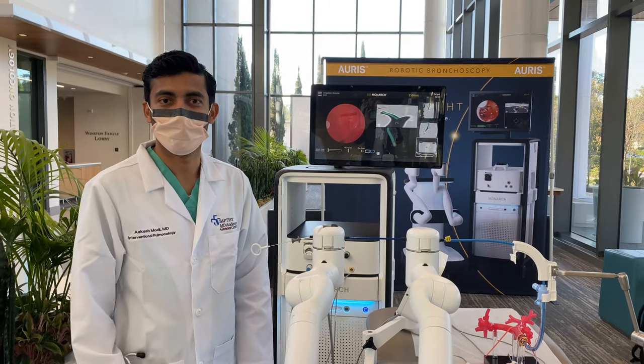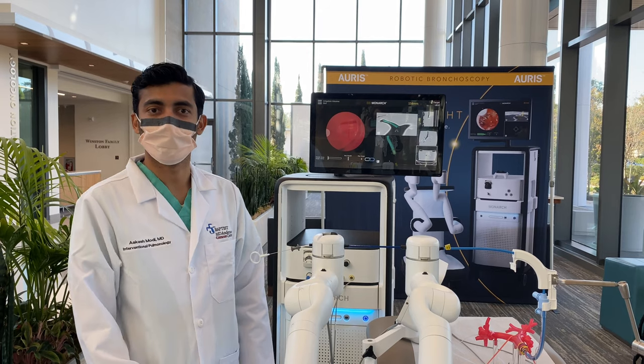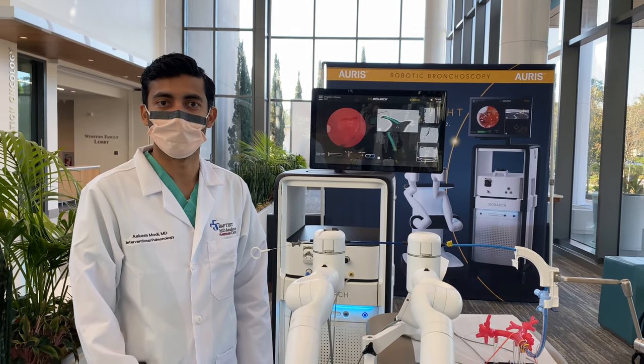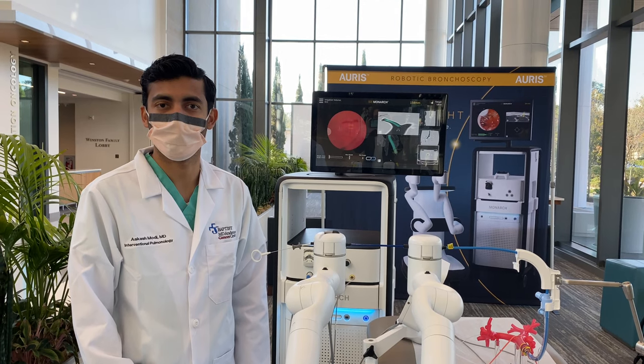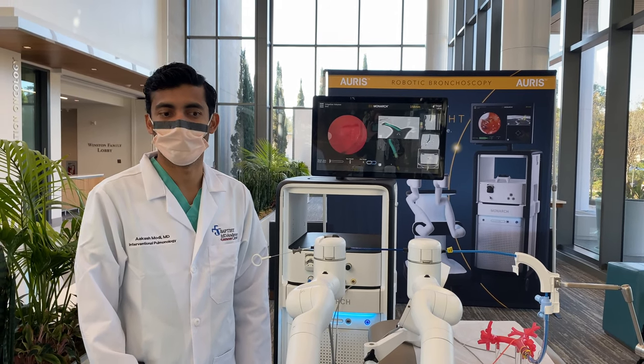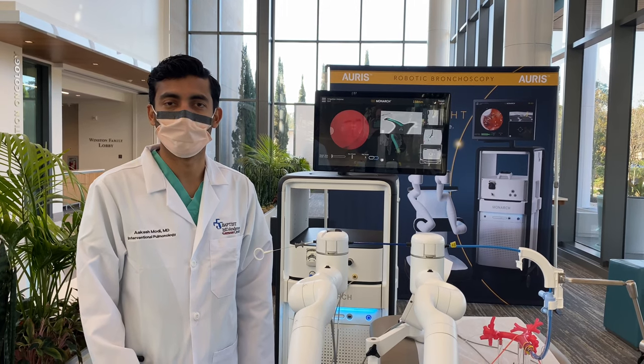Good morning, everyone. My name is Akash Modi. I'm an interventional pulmonologist at Baptist MD Anderson. I would like to take this opportunity to share a brief demonstration of our new technology, robot-assisted bronchoscopy, termed as Monarch — it's a Johnson & Johnson company — but more importantly, this is a new technology that we have acquired to benefit our patients and community.